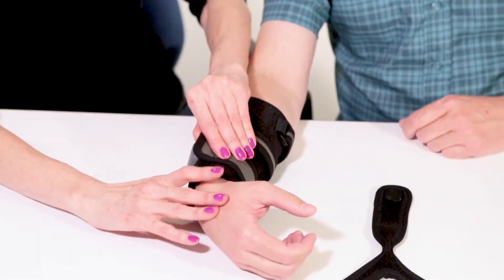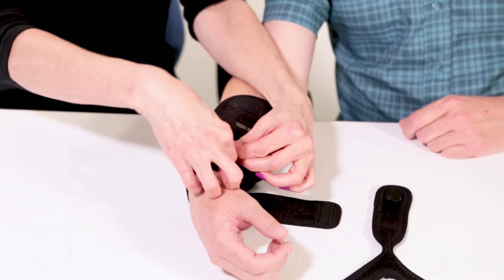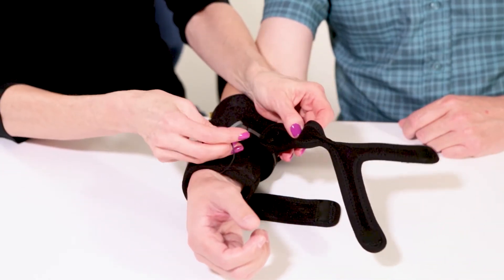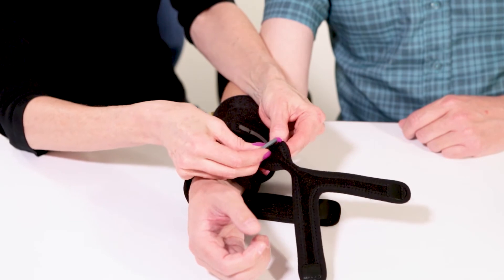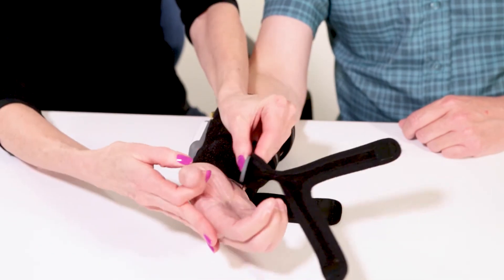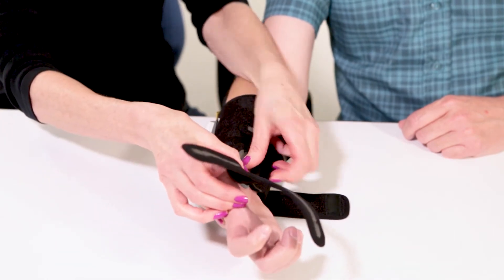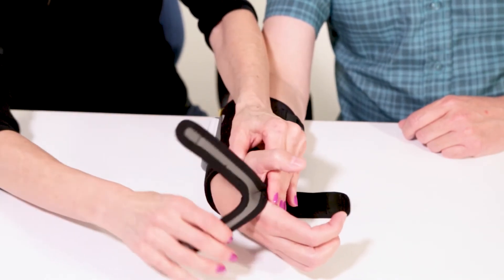To use the thumb strap, remove the thumb electrode and the movable Velcro tab it's attached to from the forearm part of the garment. Attach the Velcro tab of the thumb electrode to the thick part of the thumb strap. Place the electrode at the base of the thumb.